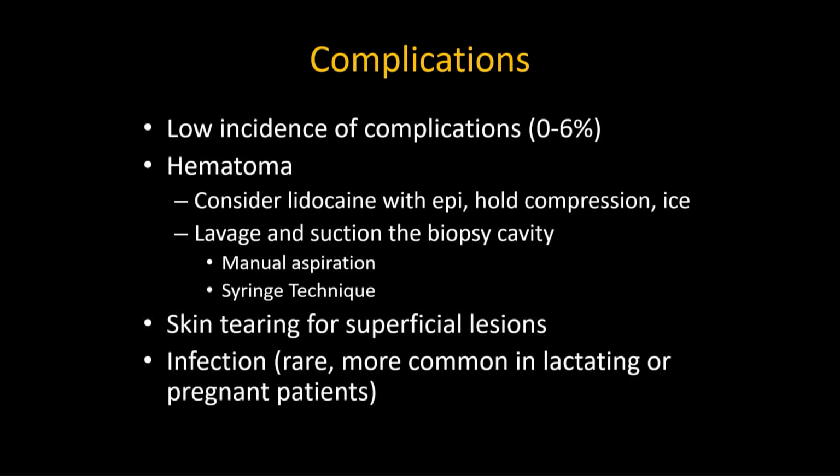So complications, there's a low incidence of complications, 0 to 6%. Most commonly, it's a hematoma. Consider lidocaine with epinephrine. Hold compression. I always say ice is your best friend that day. It's really helpful. We lavage and suction the biopsy cavity. There's 2 ways to do this. One is manual aspiration, when you place the biopsy device back into the cavity and hit manual aspiration. We also use a syringe technique for smaller hematomas.